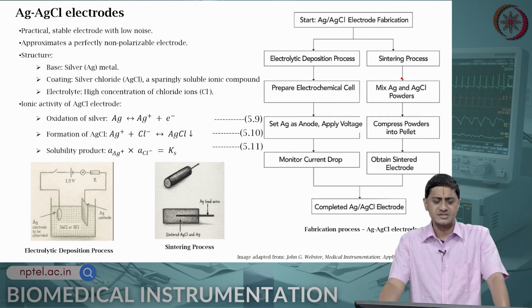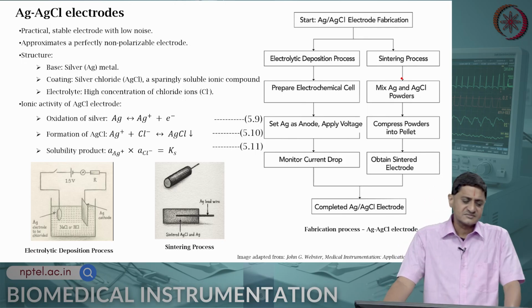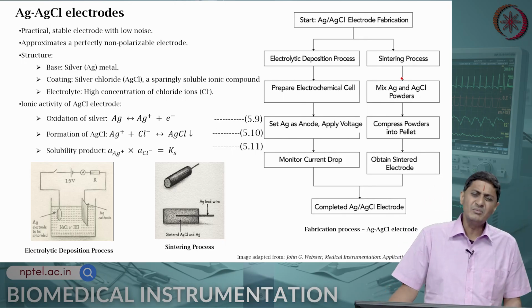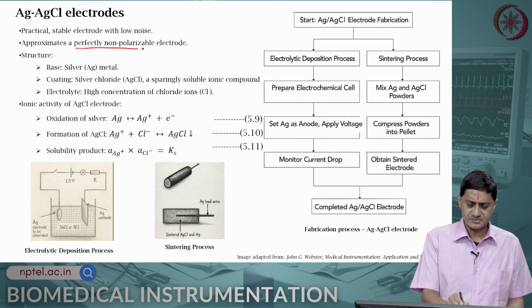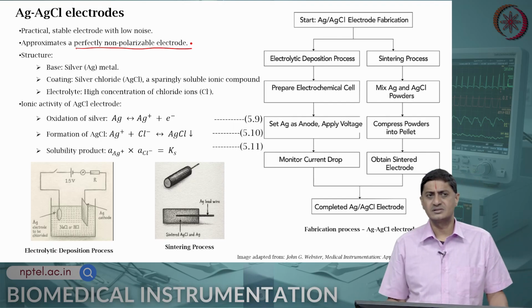Silver chloride electrodes are practical, stable electrodes, and almost a perfectly non-polarizable electrode.